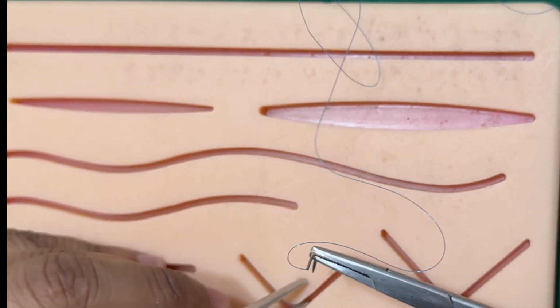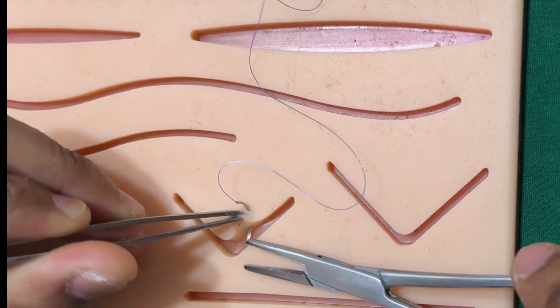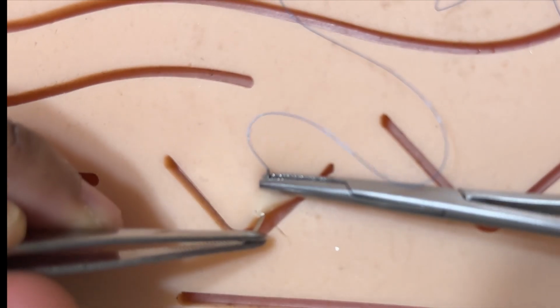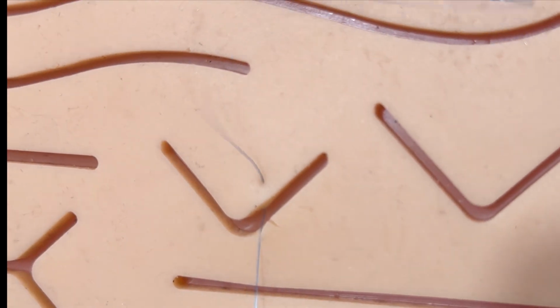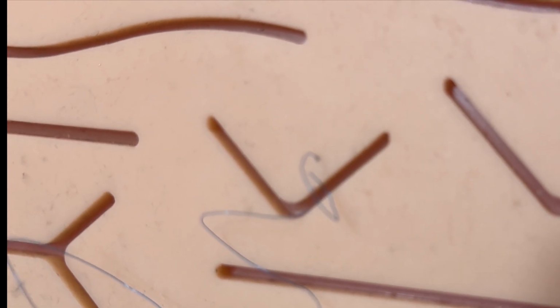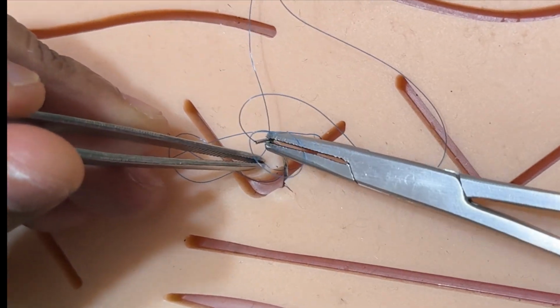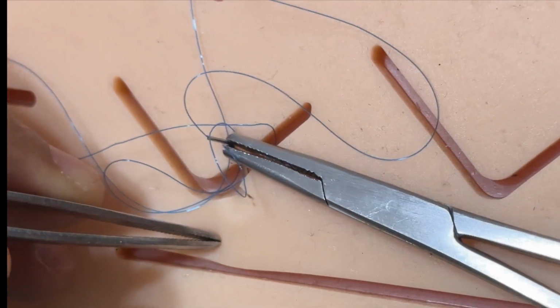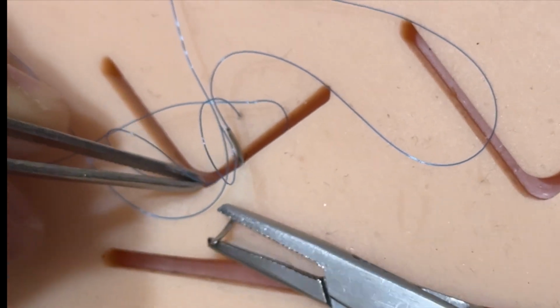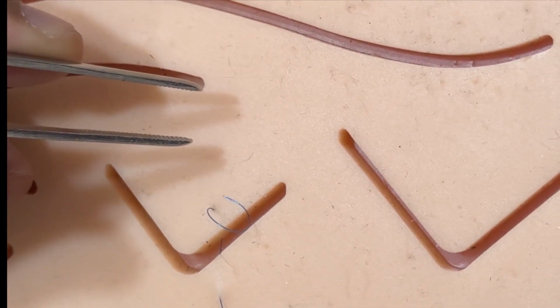Let's come back here. I'm going to take just one bite here, clear? This is the bite, I'm driving the needle out. Now after this, exactly in front of this, again I'll take a bite, but I'll come out an x distance away. Am I right? Got this much?